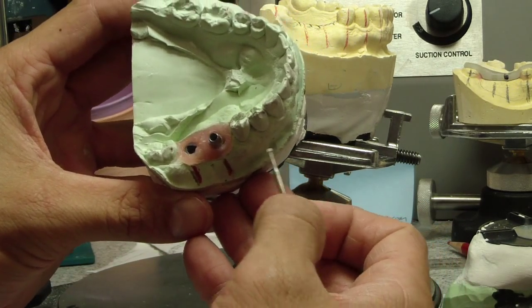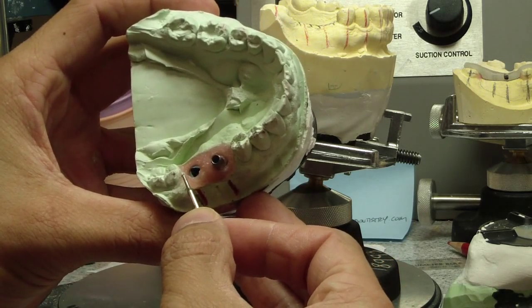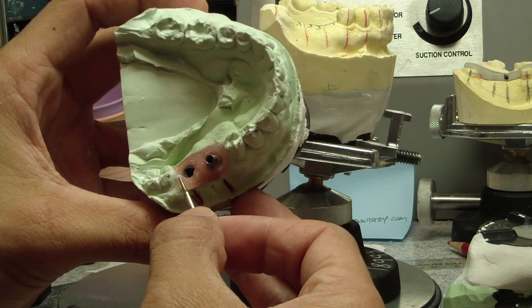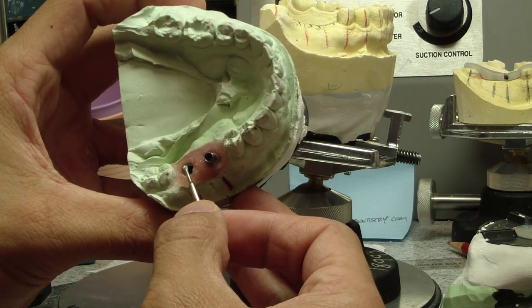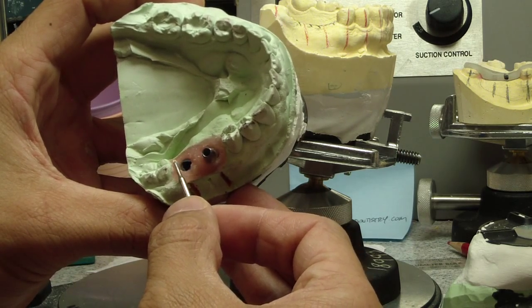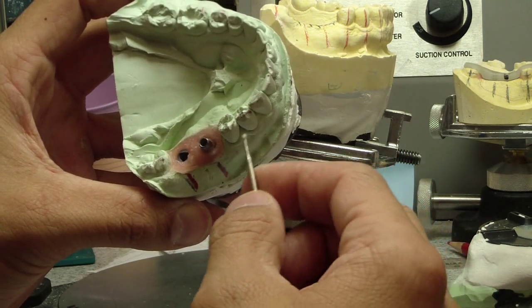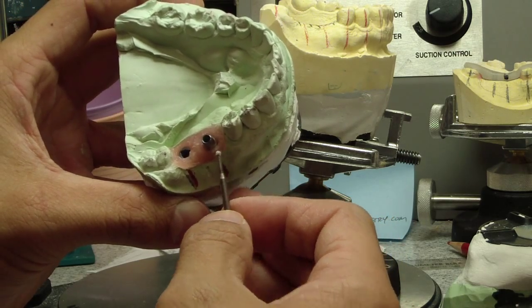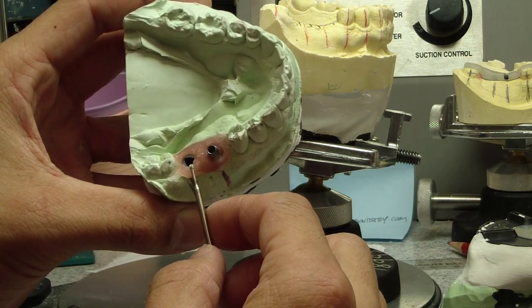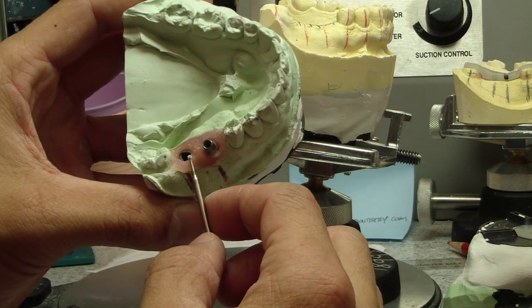You can see that on the master cast with the implant analogues. One of the problems I ran into when restoring this is that although there is sufficient room — two millimeters between the adjacent tooth and the body of the implant — my contact became very flat. I didn't have a lot of room to create a nice concave or convex contact. So when we make the stent today, we're going to have this implant placed approximately a millimeter more mesial.